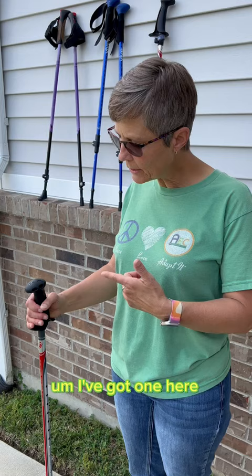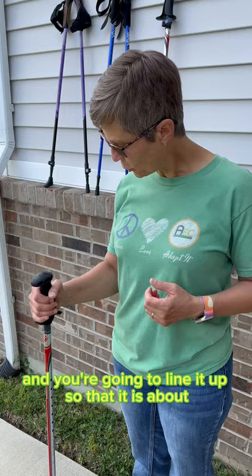I've got one here. Typically what I would say is if you can get one that's adjustable, that's great. You're going to line it up so that it is at about 90 degrees of elbow bending.